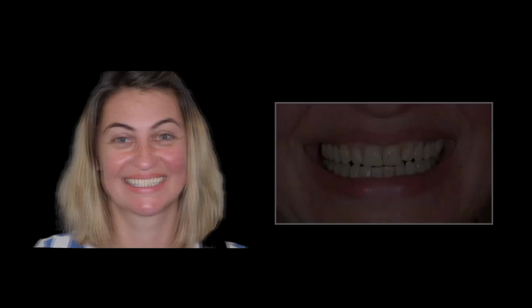You can also notice that we sometimes want to transfer the information of her face to the instrument. So I'm not a huge fan of the glasses. A lot of people use this. This is just part of the transfer system. To be honest with you, I just use photography and a face analyzer, but if you're comfortable using the glasses because it gives you some little levels and things, knock yourself out. I never see them straight, to be honest with you. So I kind of find them a little goofy at this point.